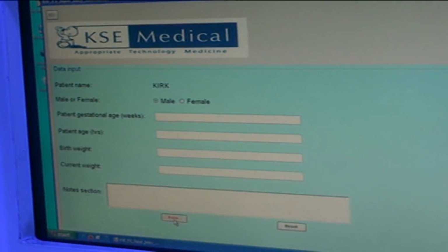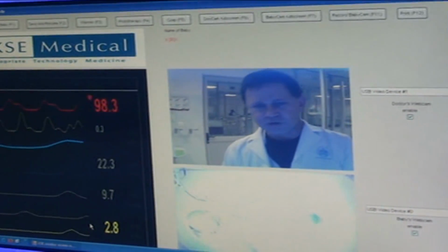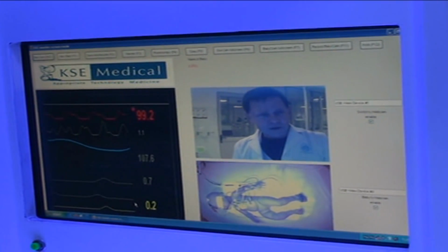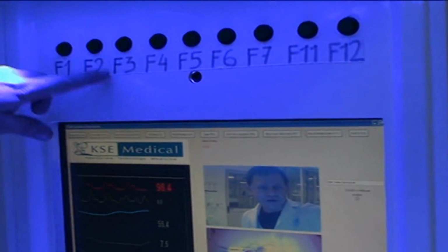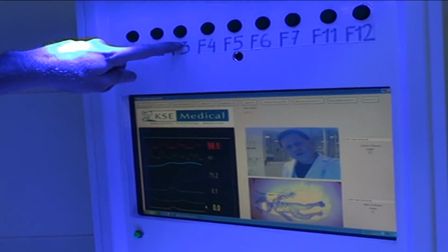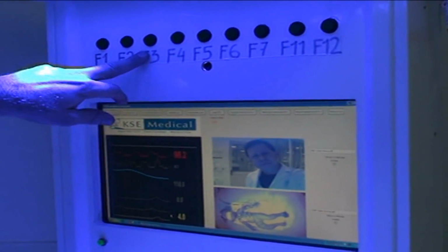So then, when that's done, we can go back to our main monitoring screen. I'll explain some of these other features in a minute. But as I say, we have the new baby button. The F3, this button, this will all be labeled later.